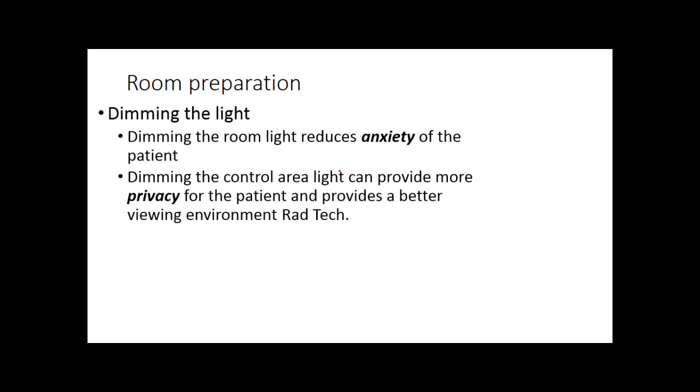When the patient is inside the room or even before, my advice is always dim the light. Why? There is science behind it. Dimming the room light reduces anxiety of the patient. This has been proved scientifically.